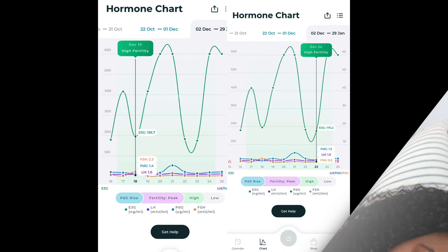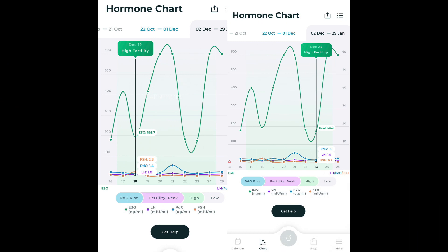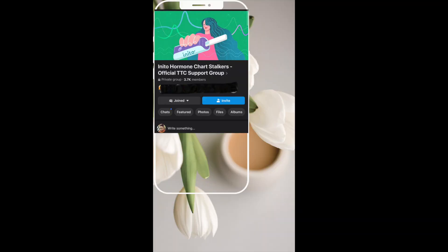These are my hormone charts that I'm sharing with you. You can see I had high fertility days from day 19 to the 24th. I think I missed my fertility peak because I wasn't checking consistently — only testing once a day. There was a notable difference in my FSH and PDG numbers; they were really high for me, which is actually out of my norm.